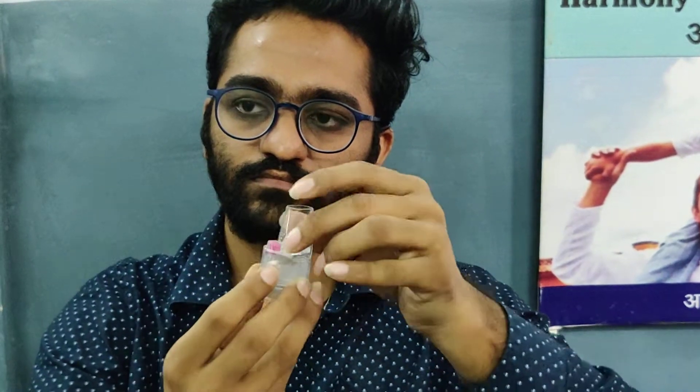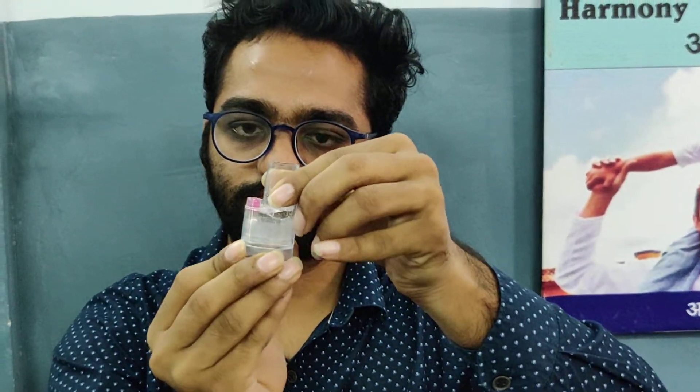Keep the rota inhaler upright by twisting the grip around and then back until a click is heard. Breathe out gently away from the mouthpiece. Now place the inhaler between the teeth without biting and close lips to form a good seal.